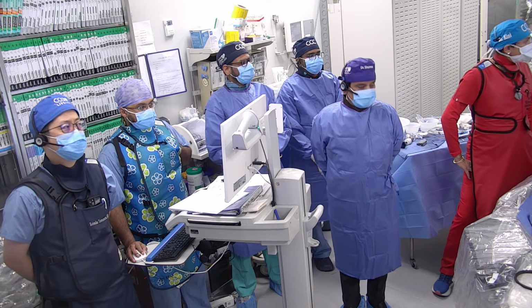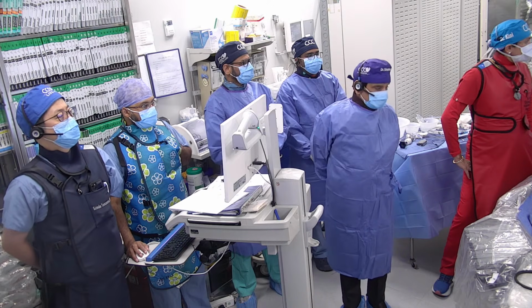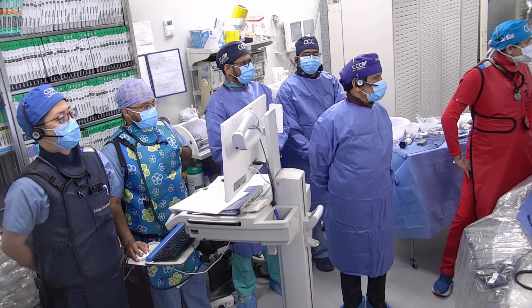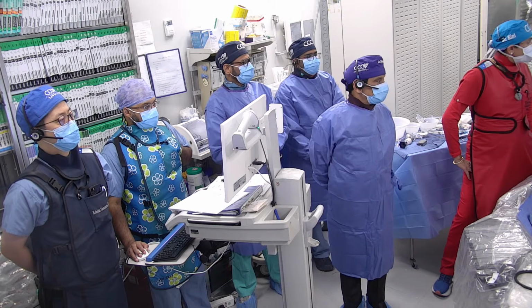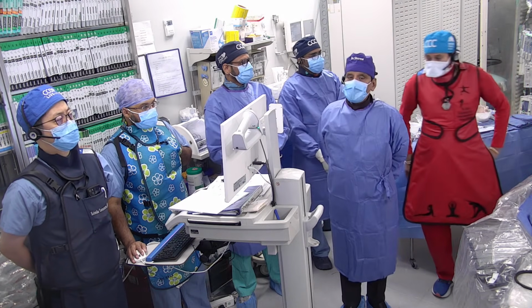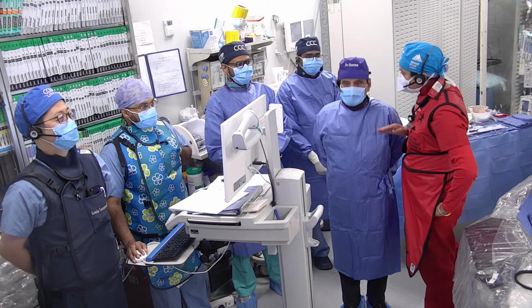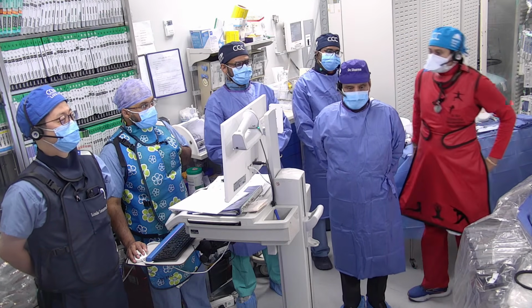So total fluoro time is 29 minutes, 08 seconds, and air kerma is, DAP, we haven't even reached 1. Yeah. So next time, I want to do a case without imaging, and let's see the fluoro time. Yeah.